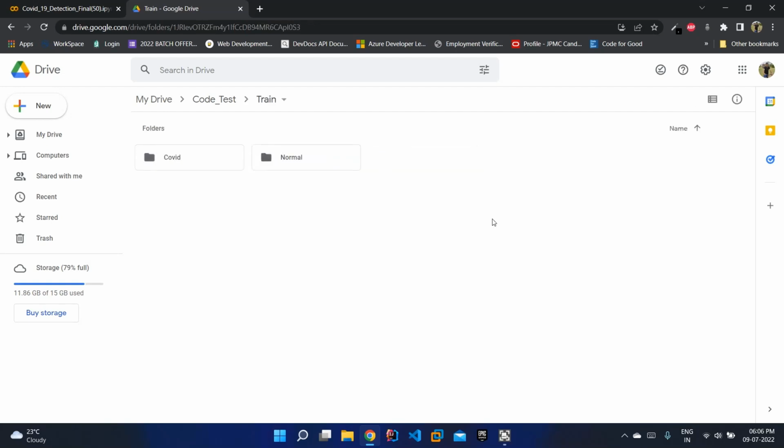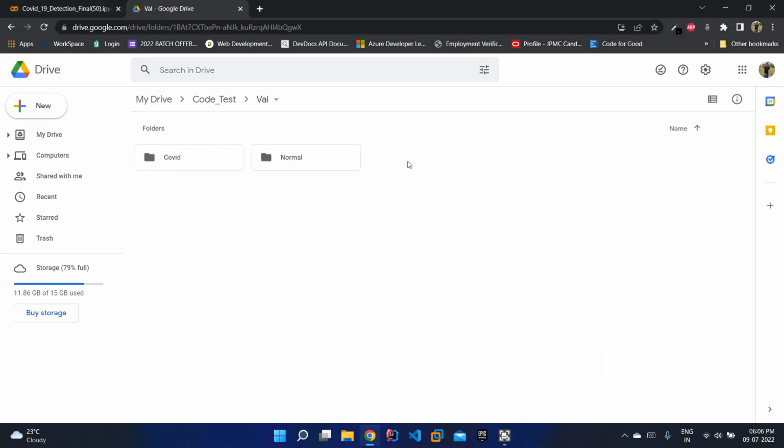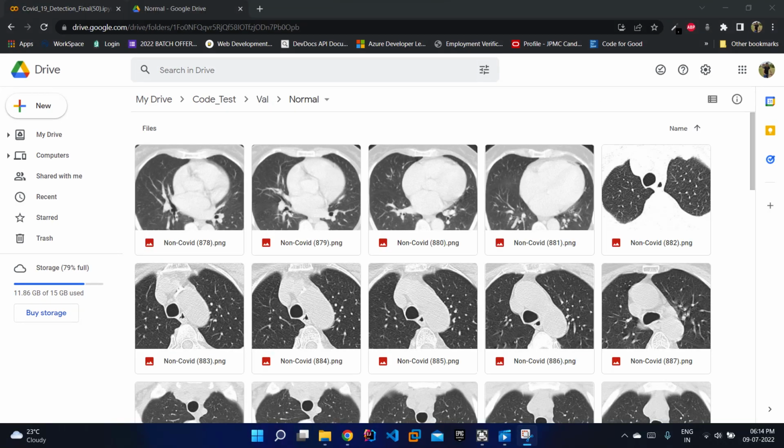Furthermore, being a classifier that we were targeting to produce, we had to label our images as COVID positive and COVID negative or normal. Hence, we took the 920 training images and segregated them into a perfect 50-50 balance, with 460 being positive samples of COVID and 460 being normal. A similar replication was also performed in the validation step, with the 232 images being split into 50% COVID positive and 50% normal images.